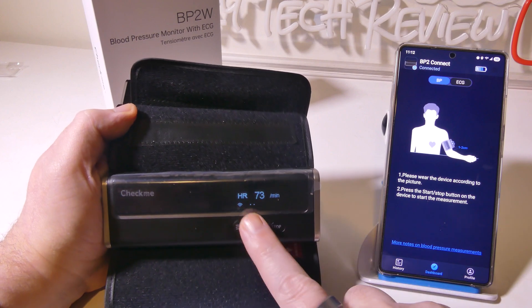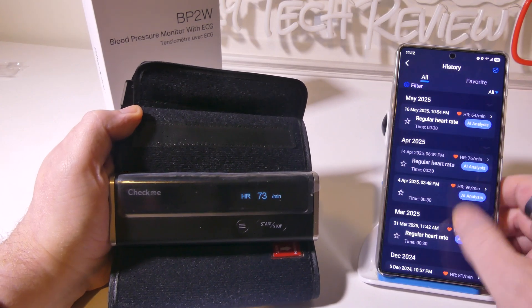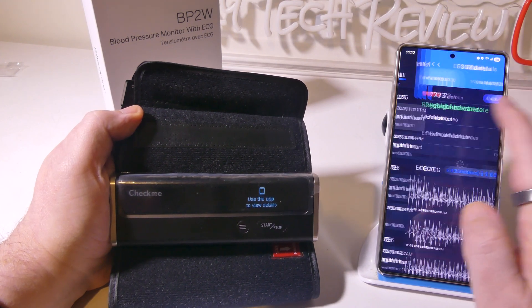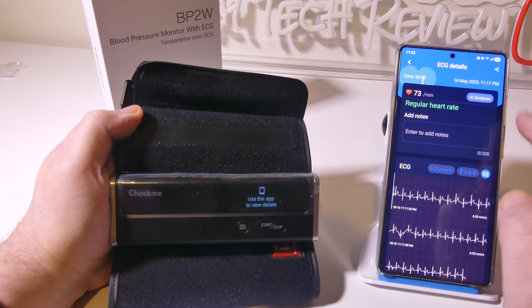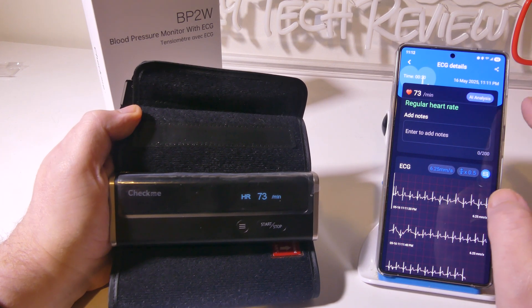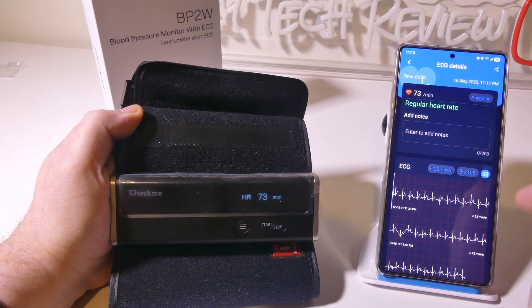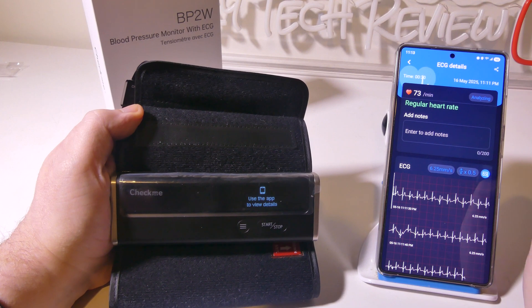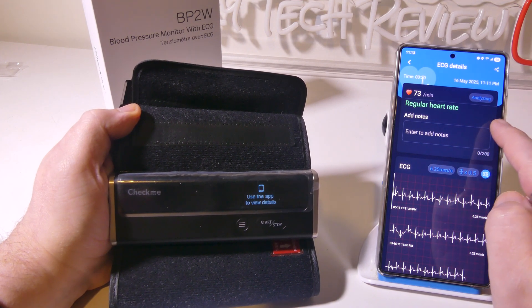The device is now uploading the ECG information to the app, and I have it connected to both Wi-Fi and Bluetooth. Going to ECG in the app, our reading just popped up. Clicking into it shows a regular heart rate at 73 beats per minute. You can zoom in and out on the ECG strip. They also have an AI analysis button, which uses AI to check your ECG for anomalies. You can add notes — maybe if you weren't feeling well or had a headache — and there's a share button to send results to your healthcare provider, friends, or family.